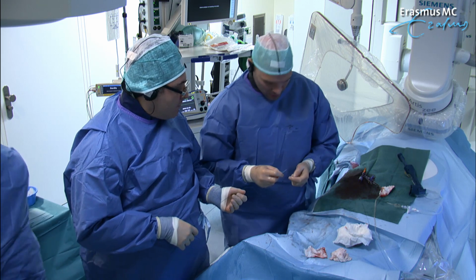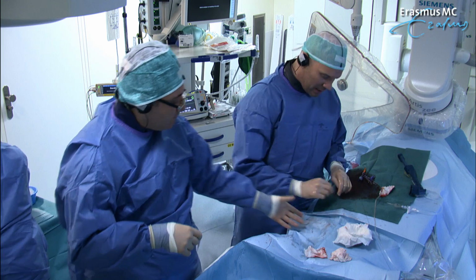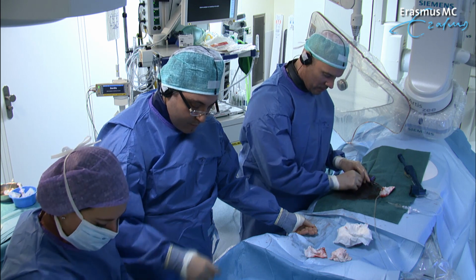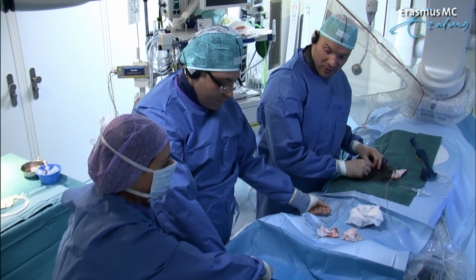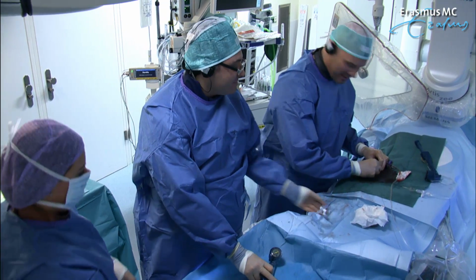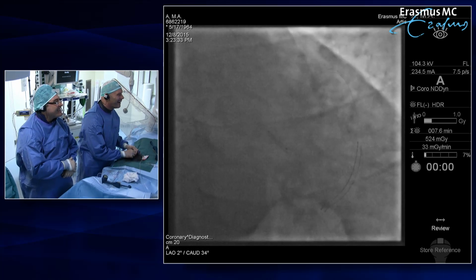And then we can work our way up to a complete T stent construction. So we already know that a 3.0 stent crosses the bifurcation into the LAD. So that was, we made that test actually. I surprised you with that technique. Yes, I was not prepared.